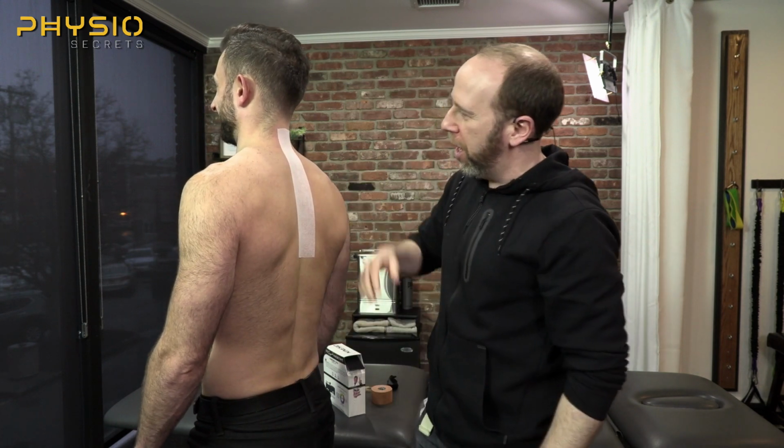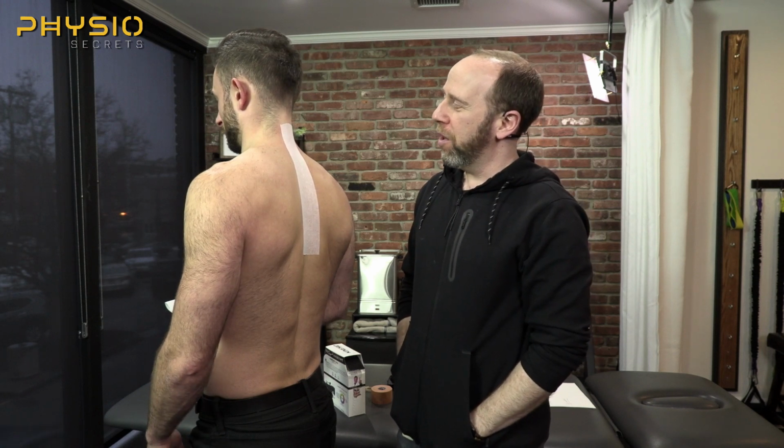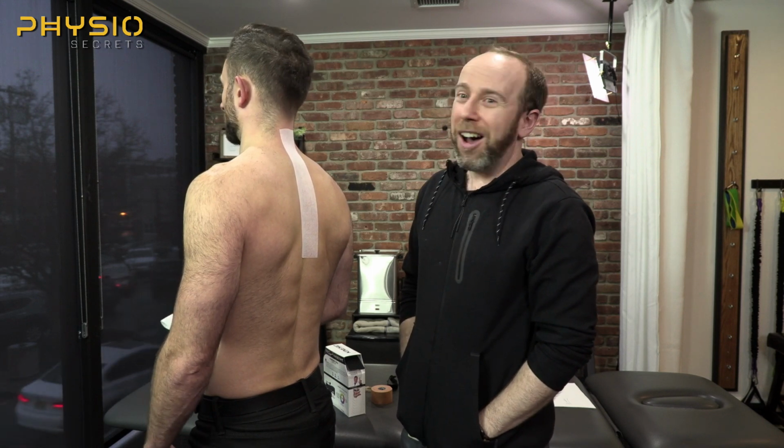Okay, now slowly bring your head down. Stop when you feel the tape stopping you. Yeah. Okay, what do you feel now? I feel the tape pulling. You feel the tape pulling. Yep. Come to the corrected position. What happened to the tape pull? Nothing. Isn't that cool? Yeah.